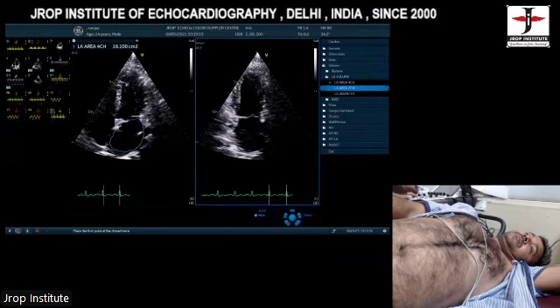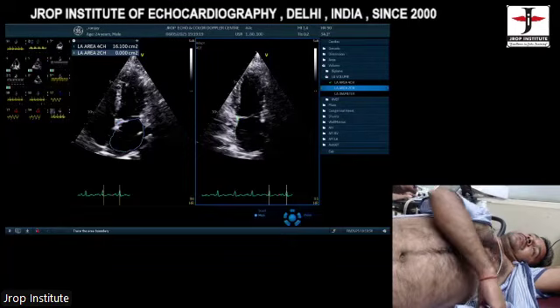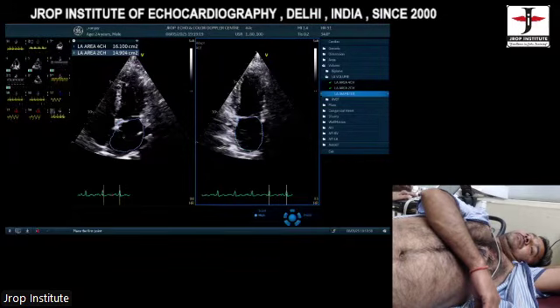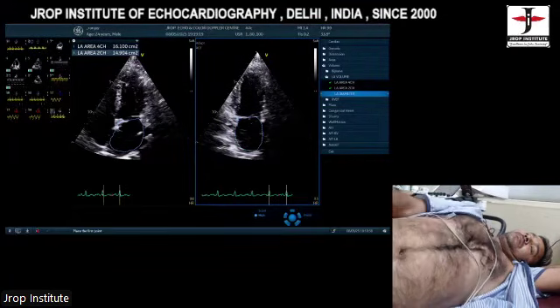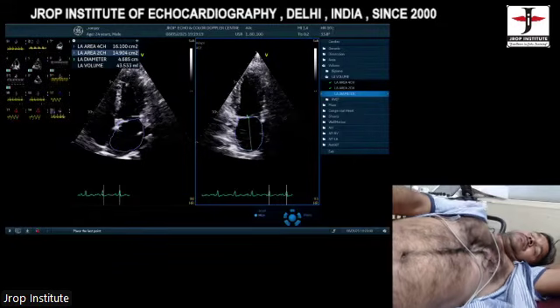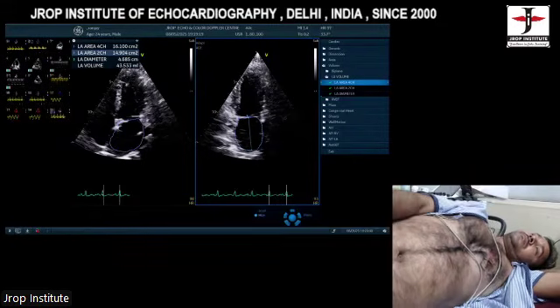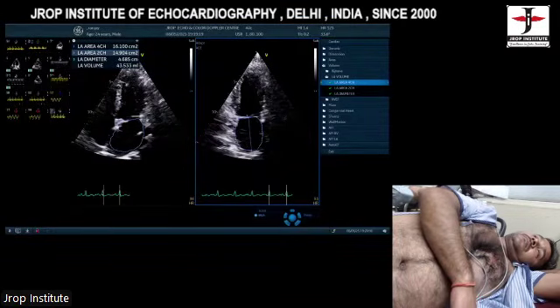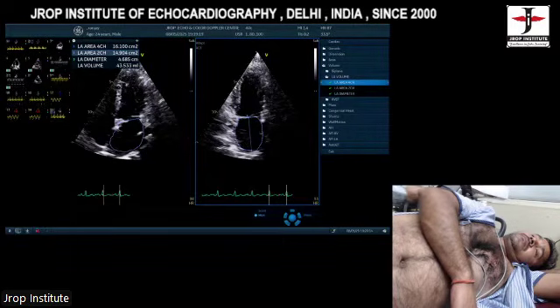One LA volume, second LA volume. This is two areas, one area, second area. Then either of this, if this is shorter or this is shorter length, this appears to be shorter. And once I draw this, if you can see on a screen, 44 ml is the absolute value of LA volumes. Divide by body surface area is 2, it is 22.